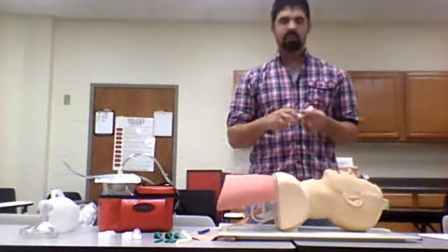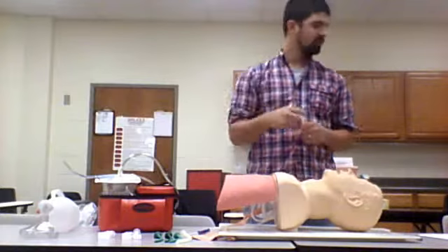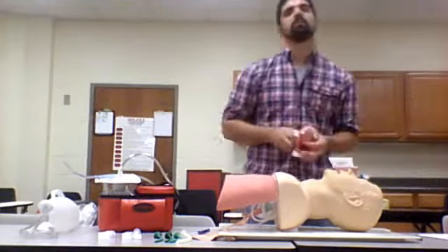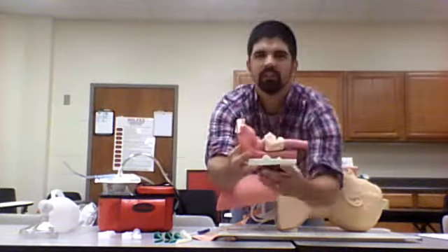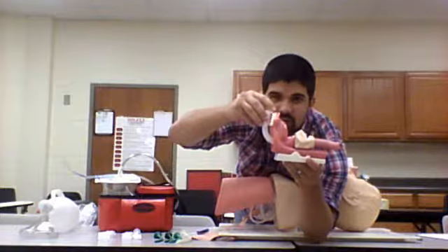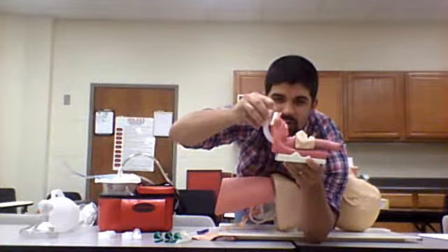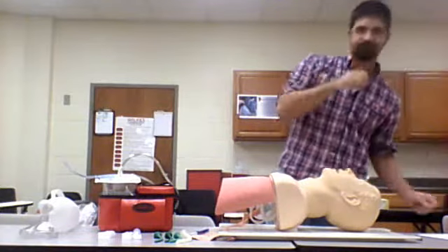And what it actually does is, you see that hook there, when it goes in, it will hold the tongue from falling back and occluding the airway.